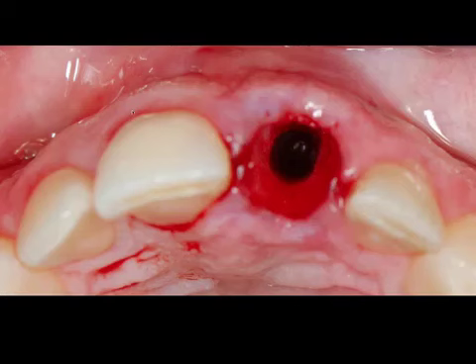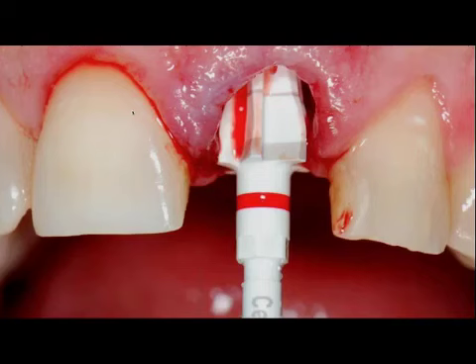We're slowly enlarging the osteotomy, of course, and we use a profile drill or a countersink in order to establish the emergence profile of the implant. Unlike titanium implants that are placed at bone level, and then we use the restoration to build the emergence out of the gum, these implants have an emergence profile built into them. And that's the purpose of the countersink, is to prepare the bone for that emergence profile.